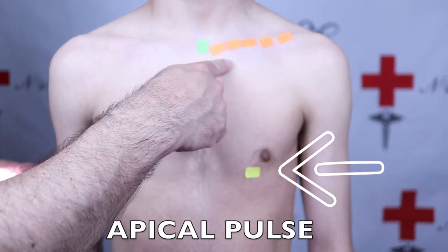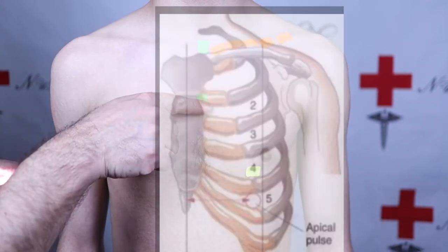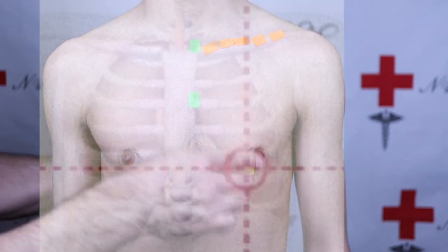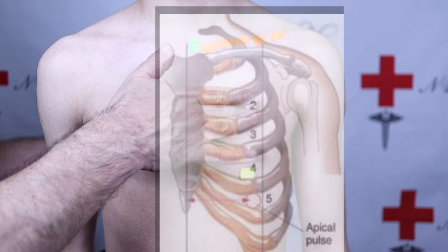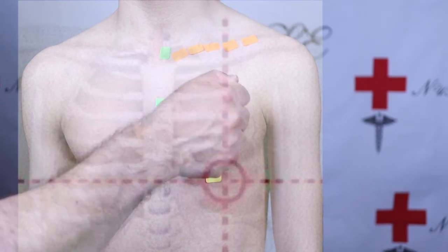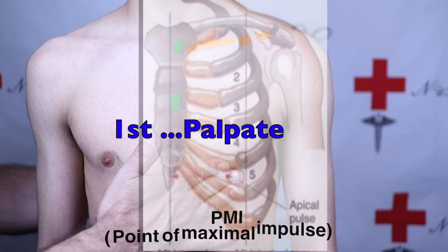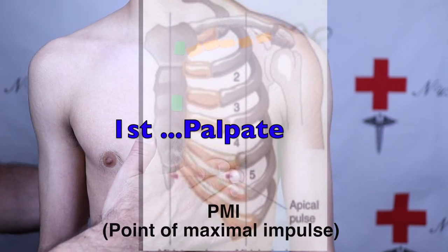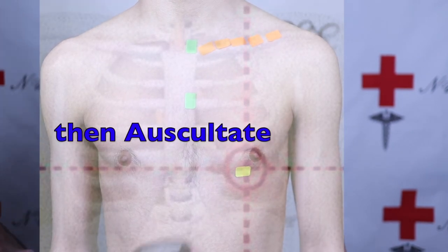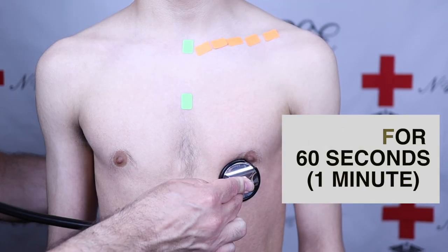To assess the apical pulse, we will need to find the clavicle, the sternal or jugular notch, and palpate down to about the angle of the sternum — about the second intercostal space. Then count down to the fifth intercostal space on the left side of the chest, palpating in between the ribs. We are looking for the apex of the heart, which is the point of maximal impulse. We will place our stethoscope on the mid-clavicular line — that's midway through the clavicle down to the apex of the heart — apply our stethoscope, and listen for 60 seconds.